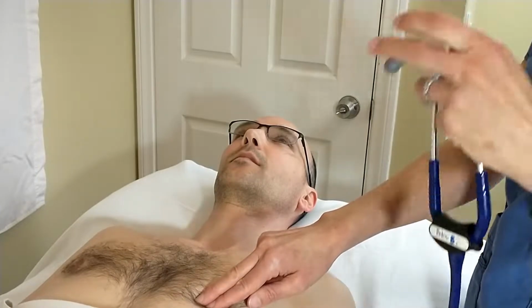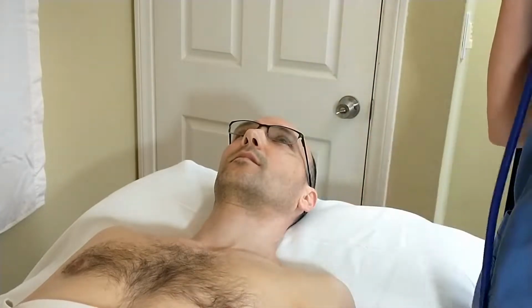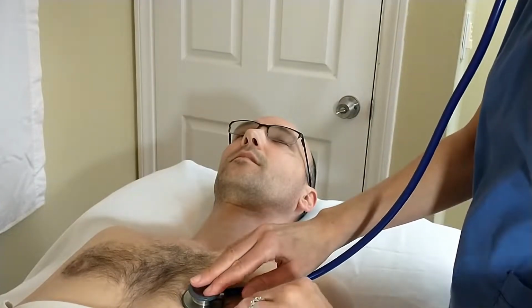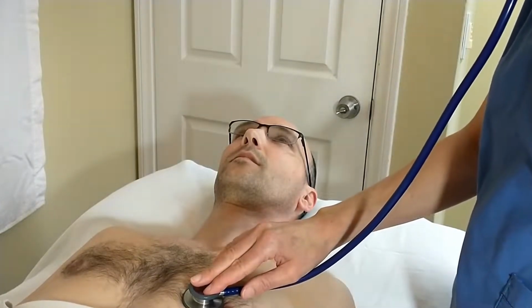So I take my stethoscope and I place it right there on that apical site, and I listen to it for a full minute while I count it.